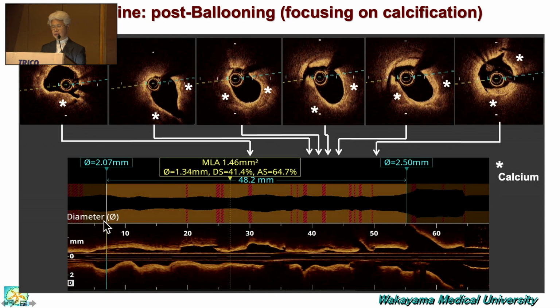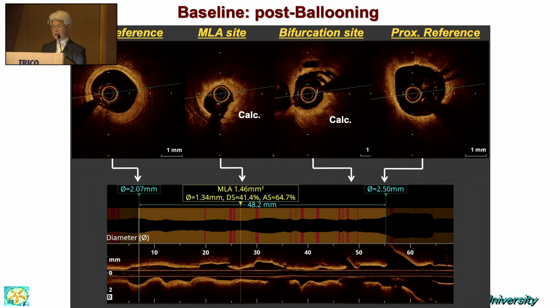Therefore, we decide the stent size based on the lumen, a quarter size bigger, so at least 2.5. And in the proximal, at least 2.75, but in the proximal LAD, we want to have 3. As I told you, the distal is 2.0 and proximal 2.5, so we decided the stent size. The length is 48. Now we have a 50 long stent, but at this time we do not have 50.